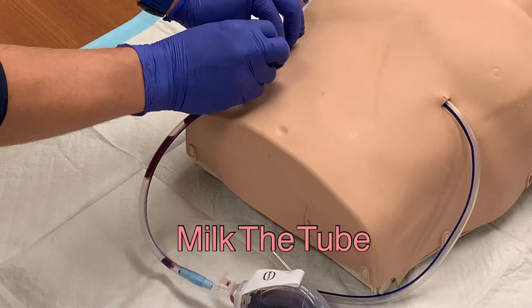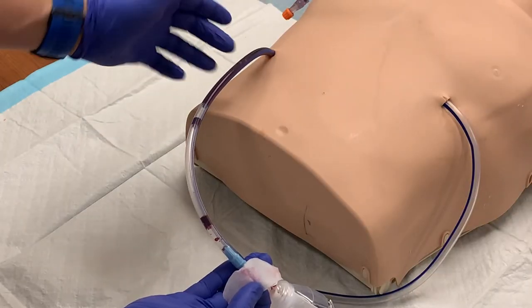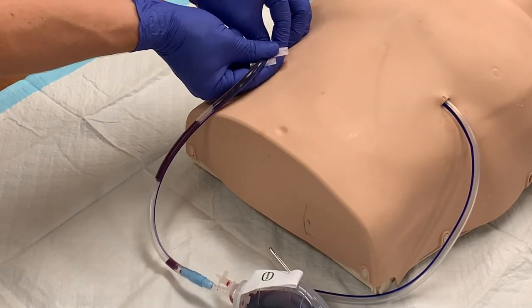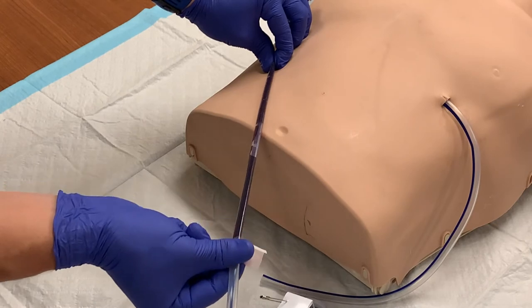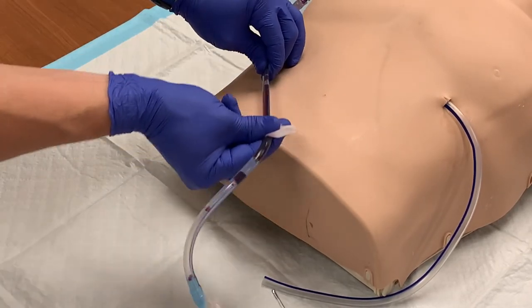Next, you will need to milk the tubing. This means squeezing the tubing to push fluid toward the bulb. You will also be cleaning the tubing while you perform this step. Take one of the alcohol prep pads. With one hand, secure the base of the JP drainage tube in place, as it is likely held in by only a couple of sutures and you do not want to risk pulling it out during this step. With your other hand, take the alcohol prep pad, wrap it around the tube, squeeze the tubing, and pull away from the patient, sliding your fingers and the alcohol pad down the tube as you squeeze. You will push fluid sitting in the tube toward the bulb. Do this multiple times. The ultimate purpose of this step is to ensure that nothing in the drainage is able to clog the tube.